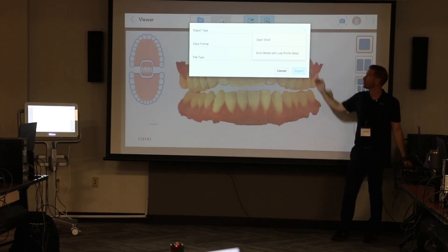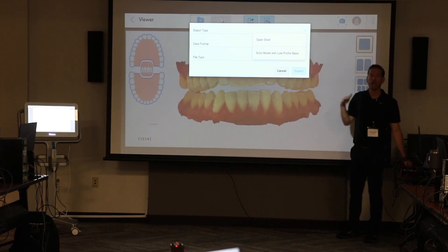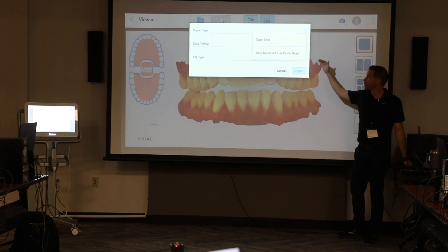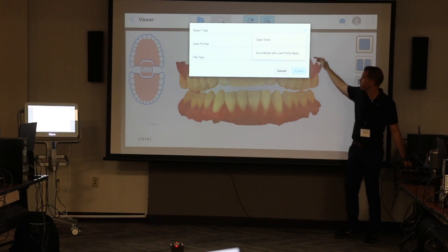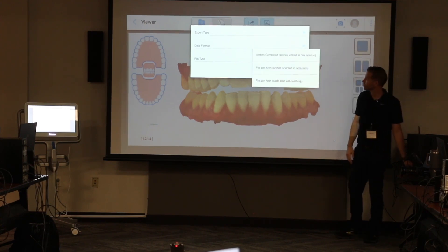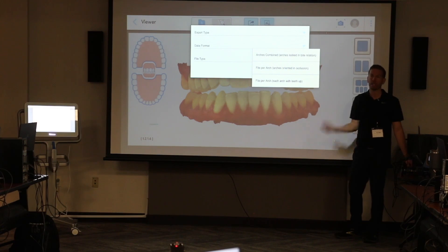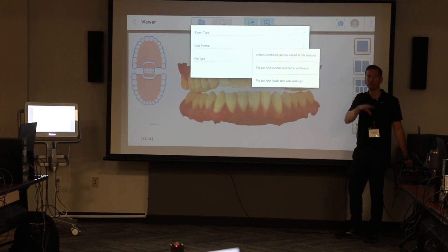Think about your application when making that decision. If you chose the wrong one, it's not hard to convert, but it's simpler to think ahead. For retainers choose solid; for surgical guides and wax-ups, lean toward open shell. When in doubt, choose open shell — it's easy to go from open shell to solid, not so much the other way. Most software, like Rayware or SprintRay, has a one-click button to add a base to an open shell.